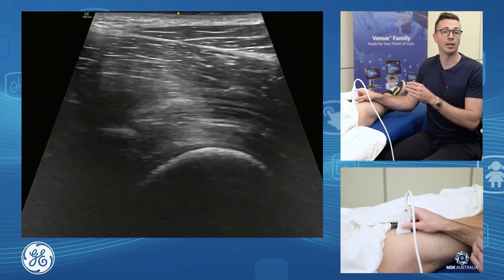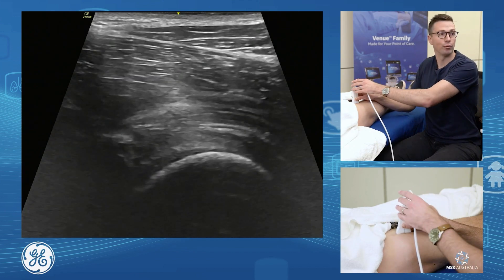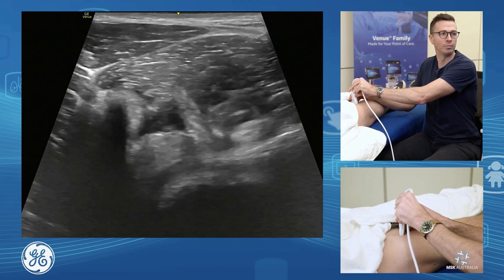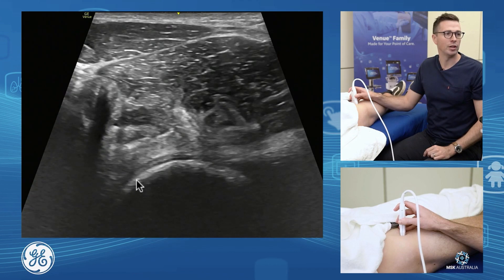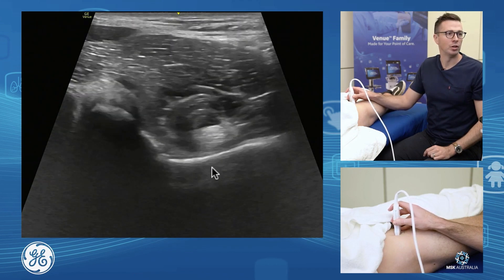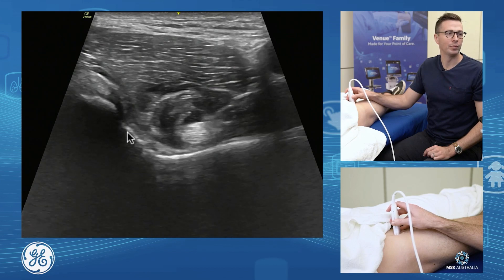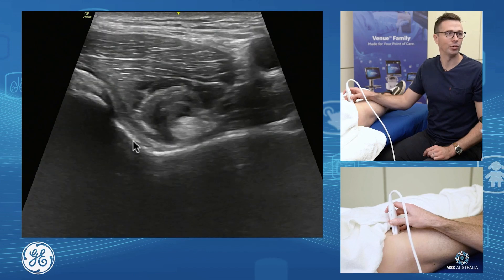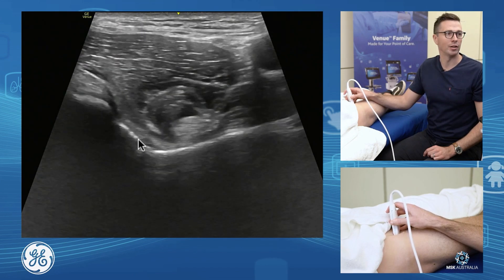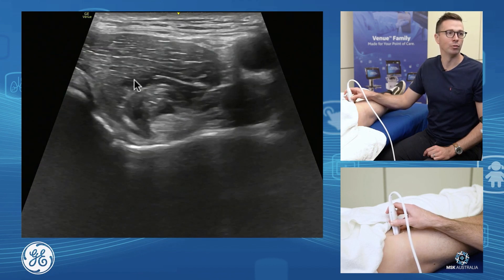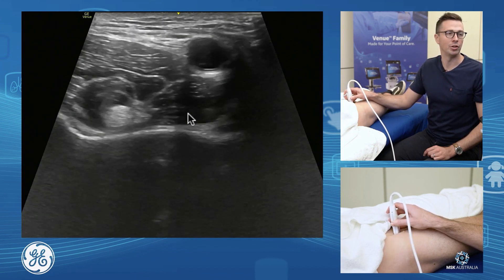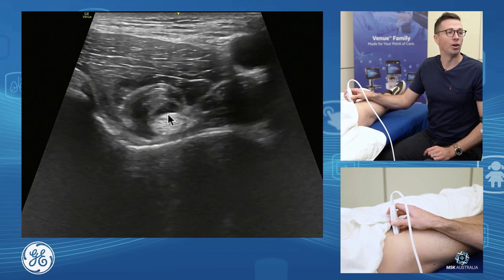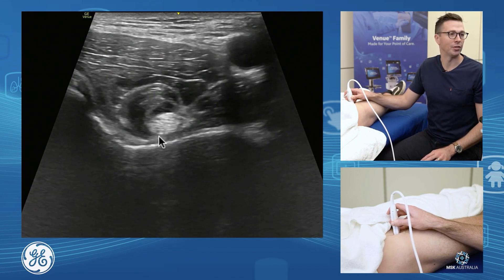From here we assess our iliopsoas complex. From the front of the joint, we get on that femoral head-neck junction and turn our probe 90 degrees. Here we are on the femoral head as we scan up onto the iliopectineal eminence of the acetabulum. We see our iliopsoas sitting on top — the medial fibers of our iliacus, lateral fibers of iliacus, residual fibers of our psoas, and neurovascular bundle sitting medially. We see our iliopsoas tendon sitting nicely on the iliopectineal eminence.